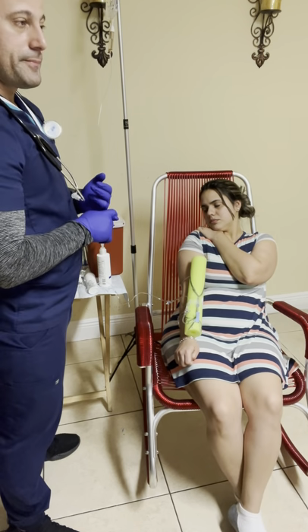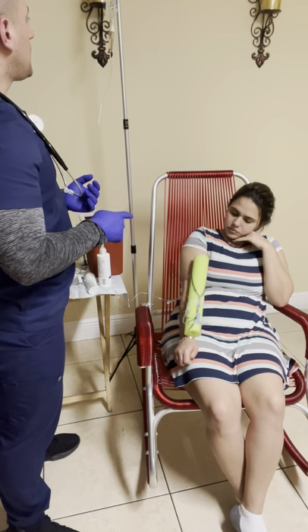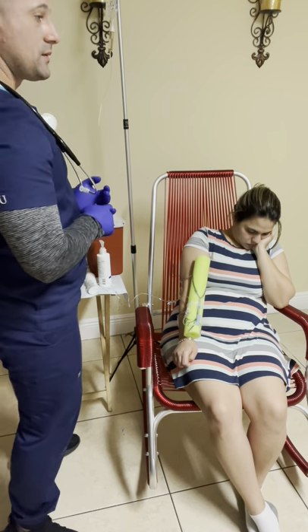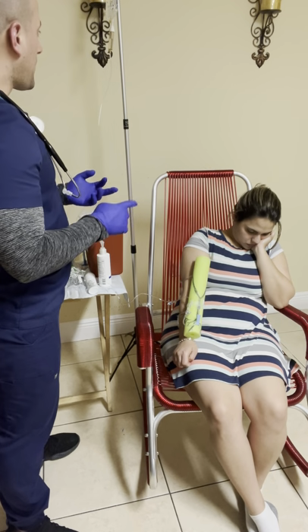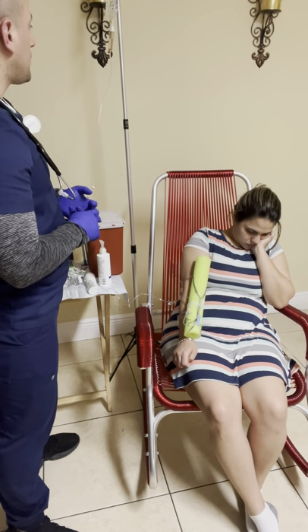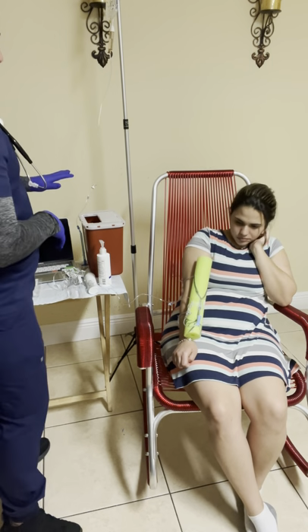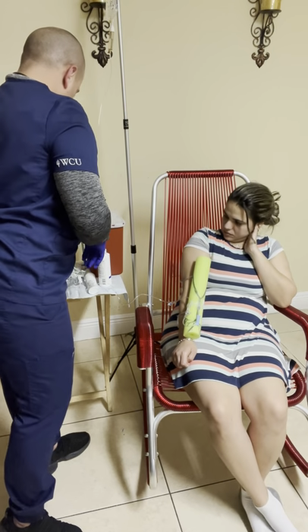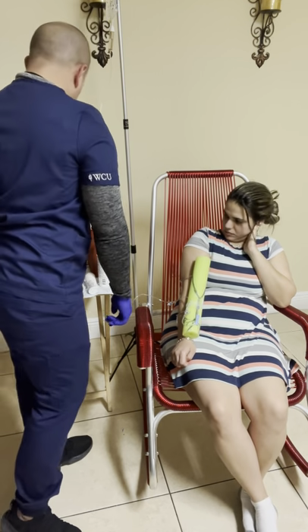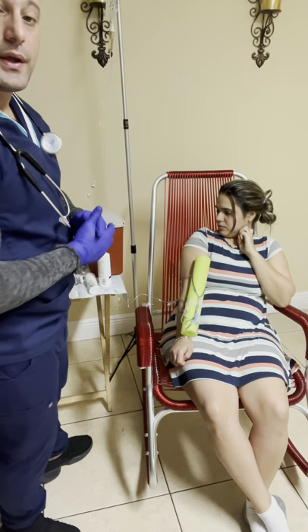Using the solution that I have to administer, I have to set up the drops per minute, and also I have to set up what kind of IV line I have. Then I have to start the IV pump and open the clamp to avoid any error, okay?